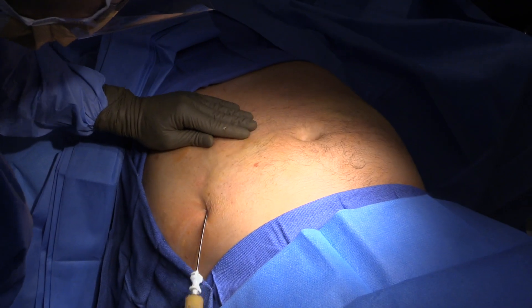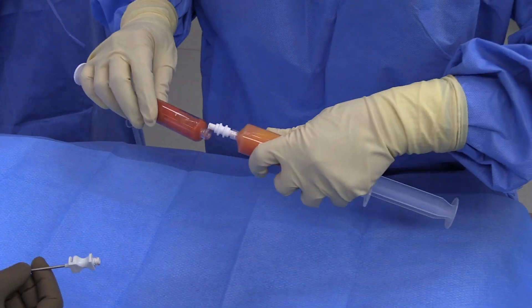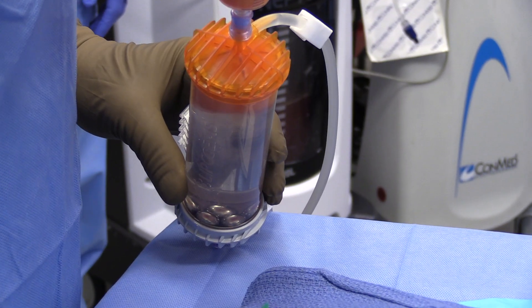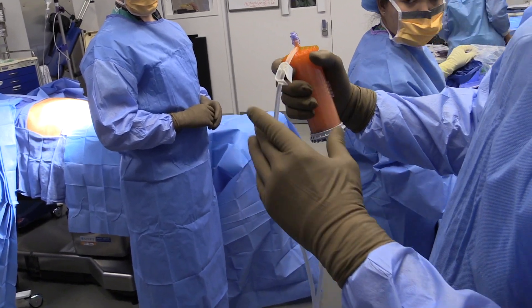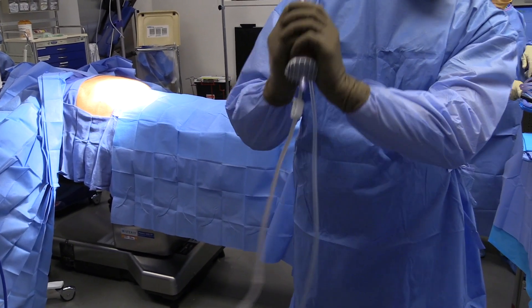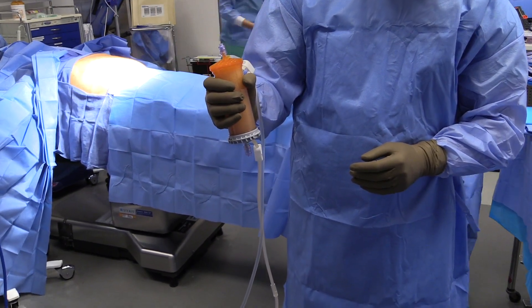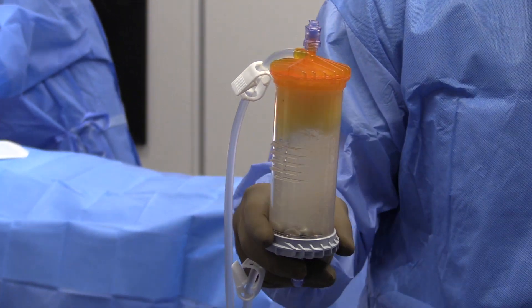As we continue to gain more fat with each additional pass of the 17-gauge needle, further processing is performed as the fat is transferred into the agitation device. This device separates the fat from the adipose mesenchymal stem cells. The clamping and unclamping process allows waste material to be separated from the mesenchymal stem cell population.